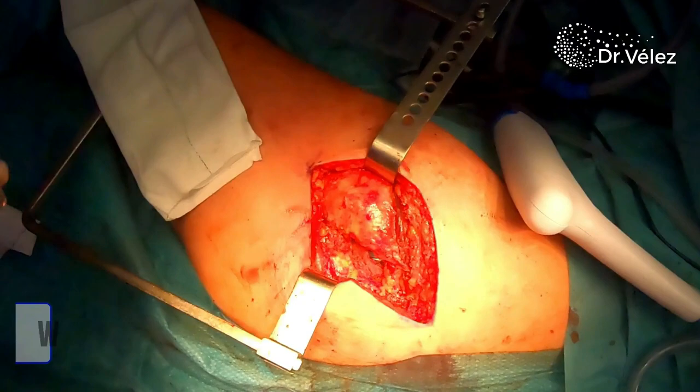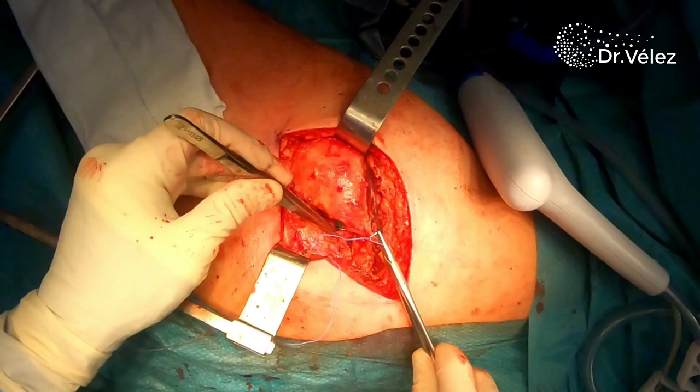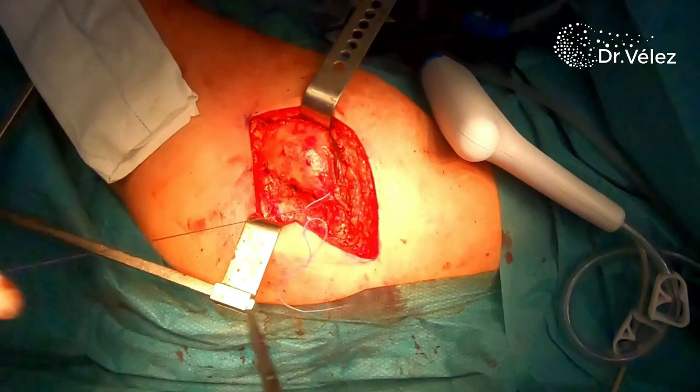After correct hemostasis, we then proceed for wound closure. We tend to use Vicryl for all deep tissues. We try to re-anchor the piriformis tendon to the greater trochanter or to the gluteus medius tendon.